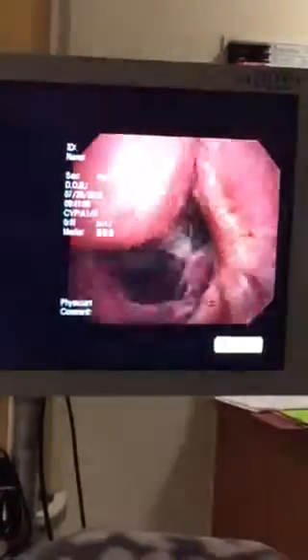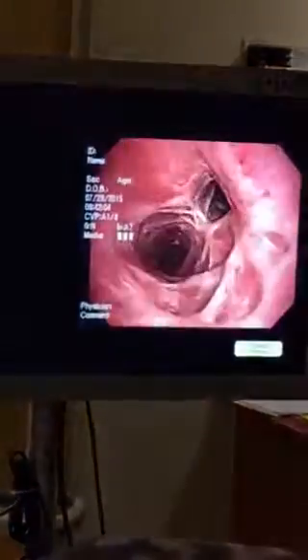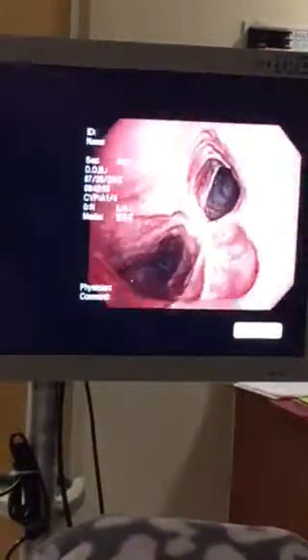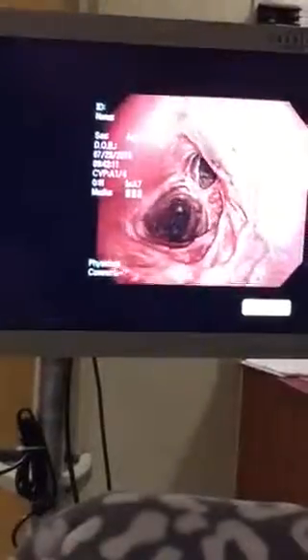But you can see the severity of the bronchiectasis there. The airways should not look like that. All right, when you get a chance, just do some more lidocaine here on the right.